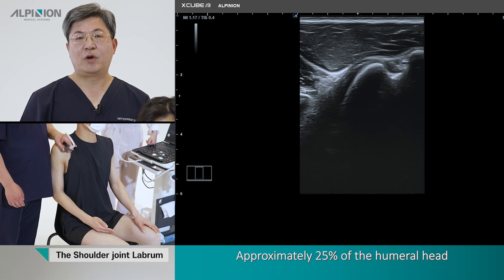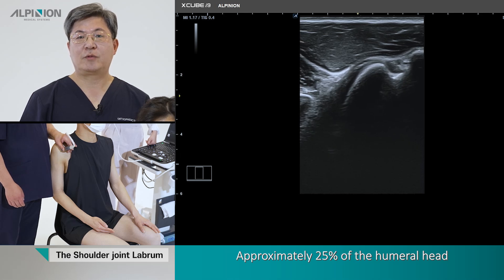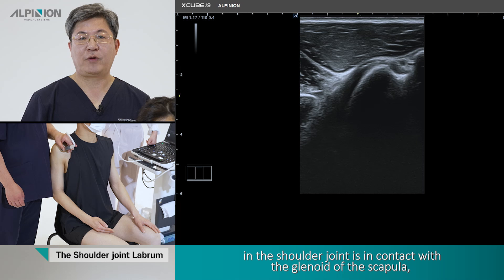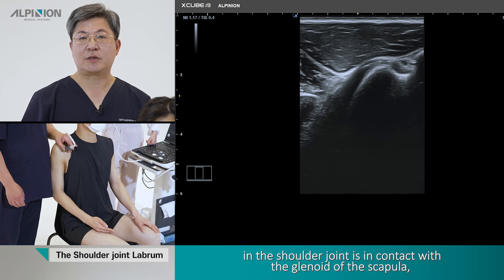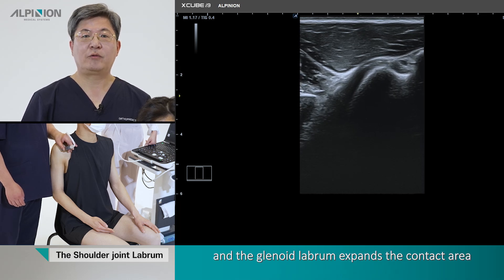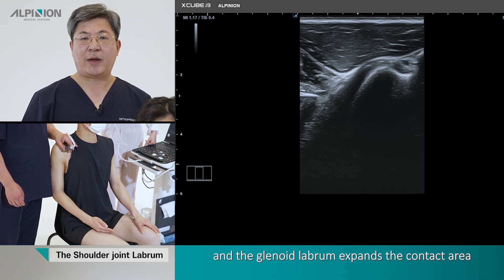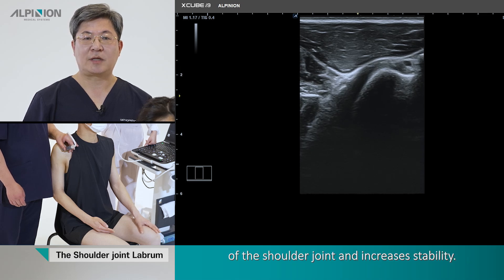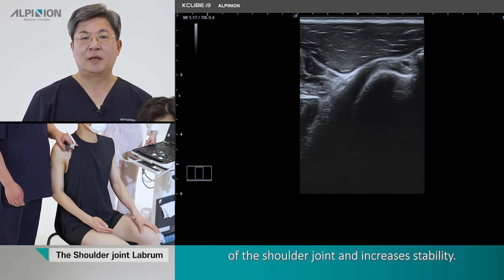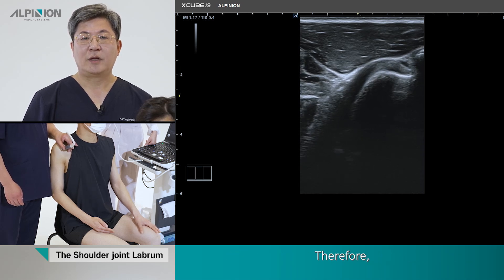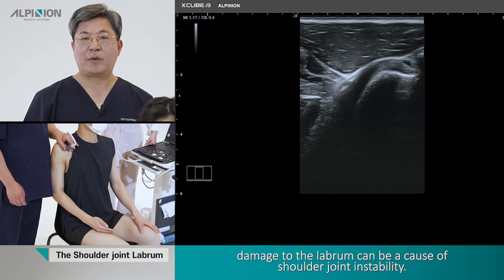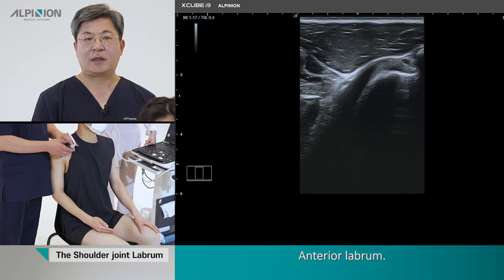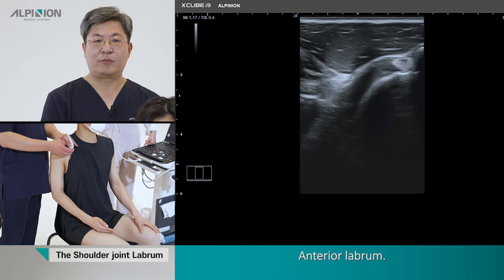Labrum. Approximately 25% of the humeral head is in contact with the glenoid of the scapula at the shoulder joint. The glenoid labrum expands the contact area of the shoulder joint and increases its stability. Therefore, damage to the labrum can cause shoulder joint instability.